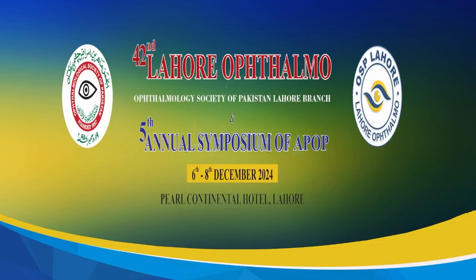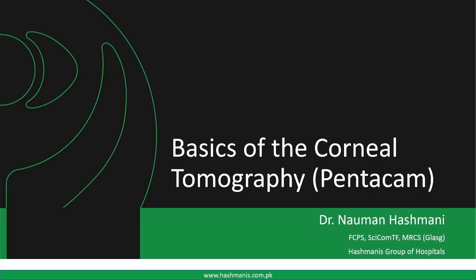हमारा आज का session, what we're trying to achieve today is to get a basic knowledge of what the Pentacam can offer, what corneal topography can offer in terms of refractive surgery. We've got some esteemed guests here, so it's a little bit nerve-wracking presenting in front of them, but I'll do my best and try to acquaint everyone with what we can extract out of a Pentacam.